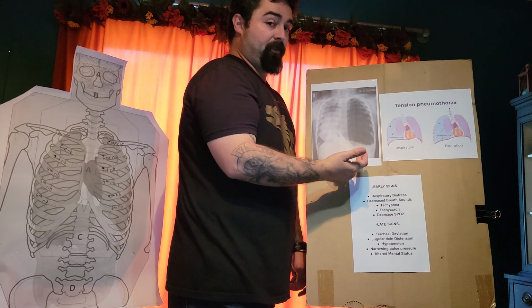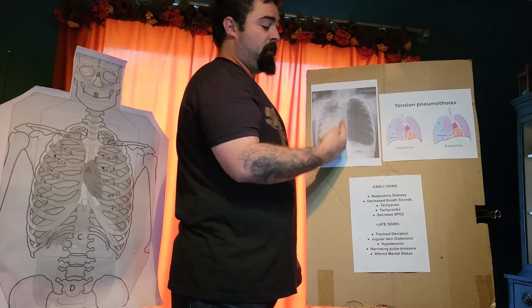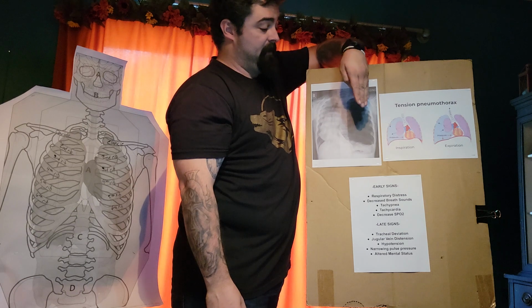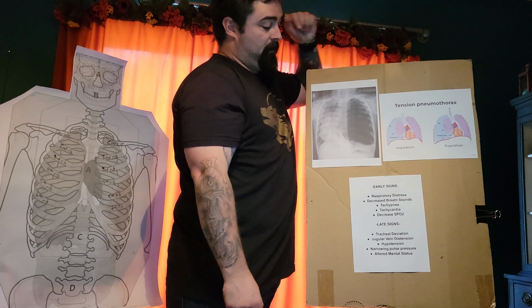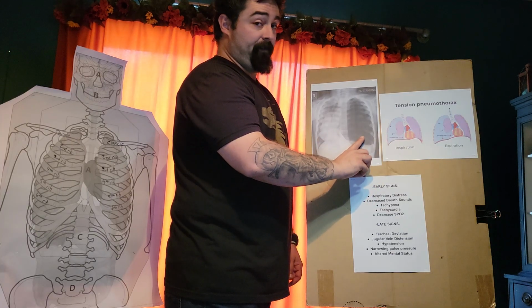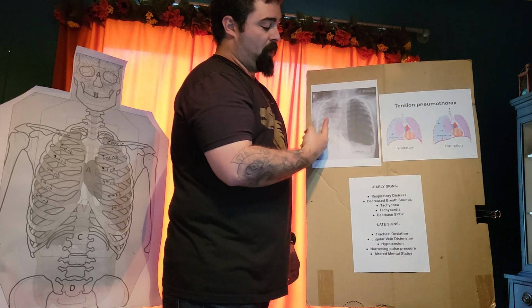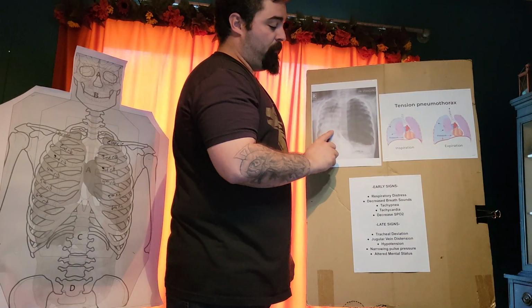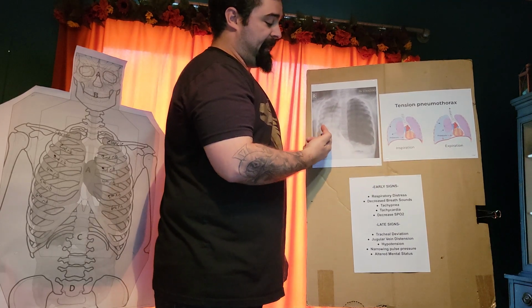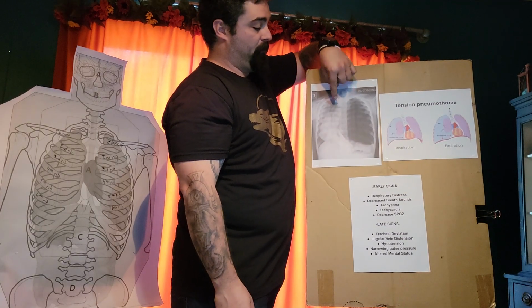Here in this picture, we have an X-ray of a tension pneumothorax. You can see all this dead space where the air is now present. The lung is not expanded. You can see the left to right shift. Again, the affected side in this diagram is the left side, pushing to the right. You can see the heart has made a complete move over from the left to the right side. You can see the diaphragm is now being pushed down and against. You can see up top the trachea has made a midline shift to the right.